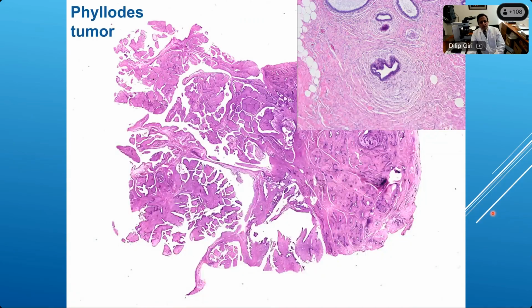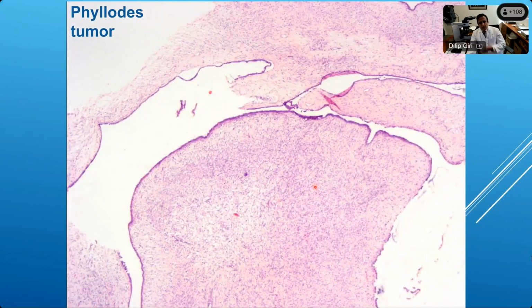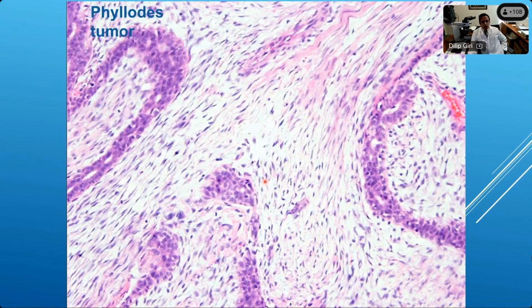So here is a typical example of Phyllodes tumor. It's called Phyllodes because it throws this finger-like or grape-like appearance into these cystic spaces. So you have these fronds of papillary projections projecting into cystic spaces, but you will have highly cellular stroma encircling these ducts. The cellularity will almost always be higher than that seen in the fibroadenoma. Again, you will see quite cellular.